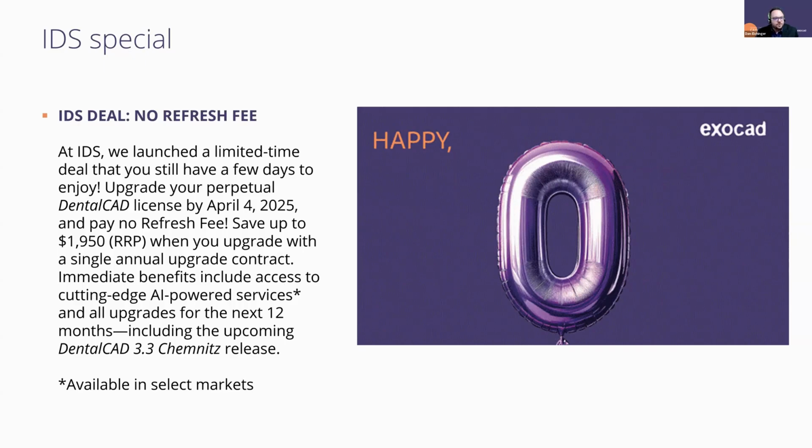But I'm sure you all are aware, every year our development team puts out amazing new features and workflows that open the doors for further digital workflow. So for those of you that are out of contract, this is a big savings.